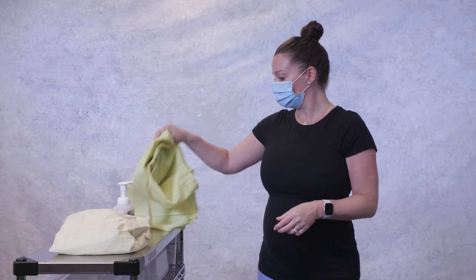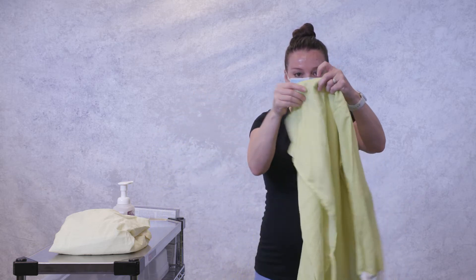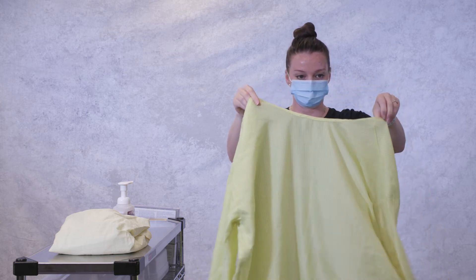Next, unfold the gown, making sure the ties are not already tied. If they are, untie them or choose a different gown. Put your arms through the sleeves of the gown.